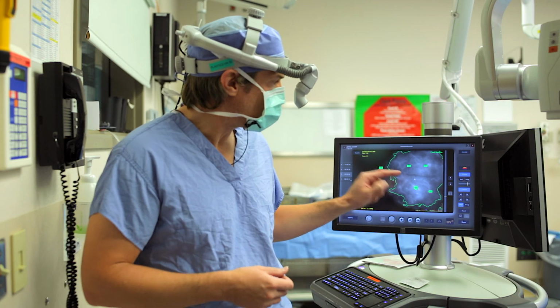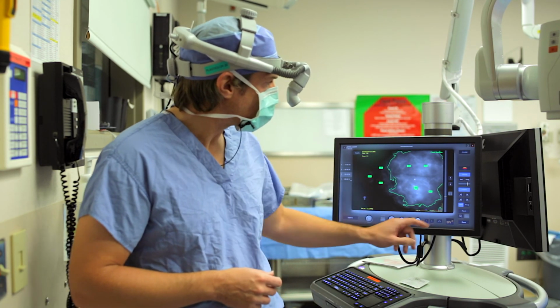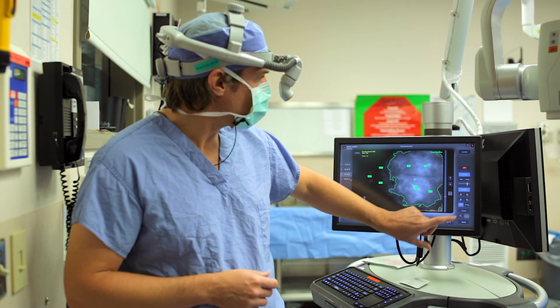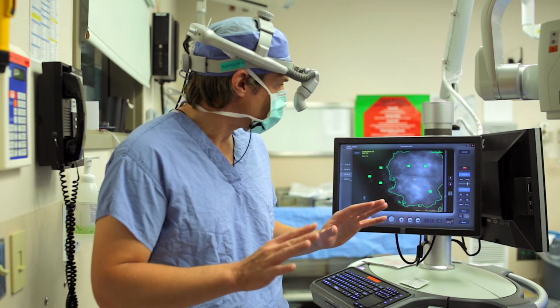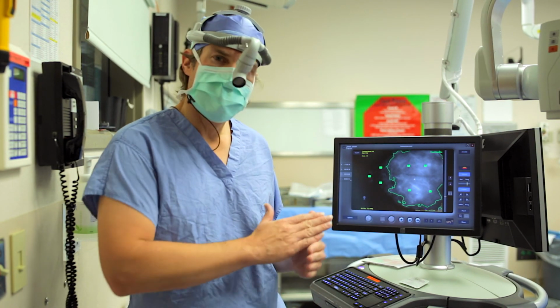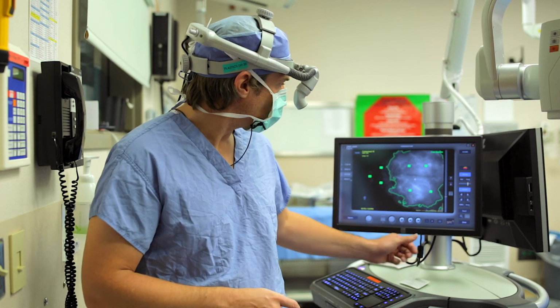Relative to this area, which is 100%, how well is this area perfused, that area perfused, and so on. If the relative values are confusing for you, you can just say, give me the absolute numbers. I just want to know how bright it is. And you can tap the screen, and that's a 37 on a scale, again, we talked about, from 0 to 254. Let's play this image forward.